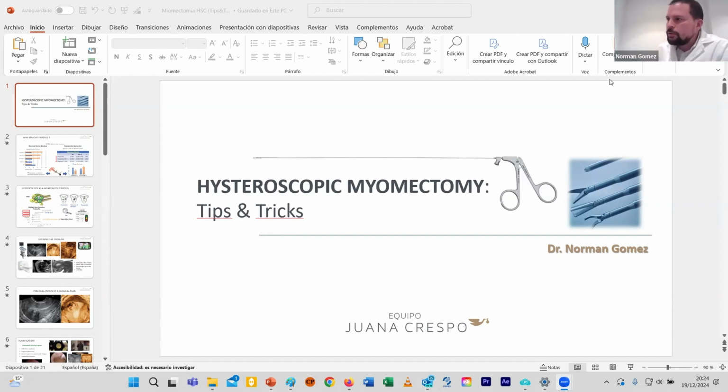Yes, it's a good question. You mean that I only expose the fibroid and leave it there without detaching at all inside the uterine cavity? Okay. Yeah. I think you need to expose the fibroid very well from the window of the blade, because the blade sometimes does not have much suction force to detach the fibroid from the uterine wall.